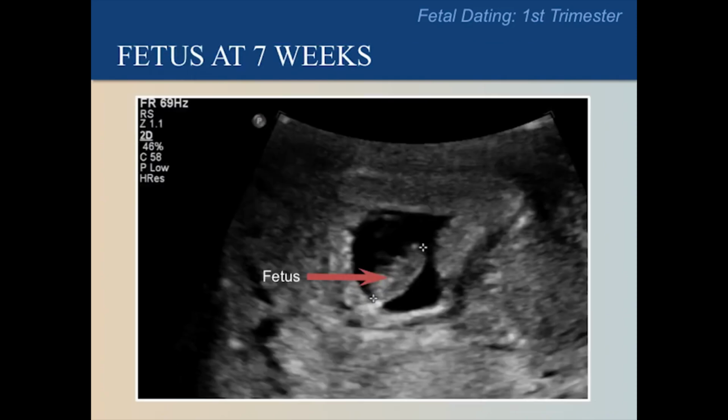This is an image of a very early fetus at approximately 7 weeks. If you see a fetus, look for the heartbeat. Remember that we must have a heartbeat in our ultrasound protocol for fetal dating. If you can't see the heartbeat, send the patient to your referral hospital.